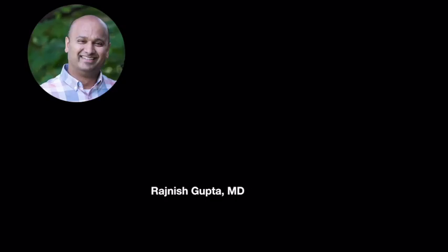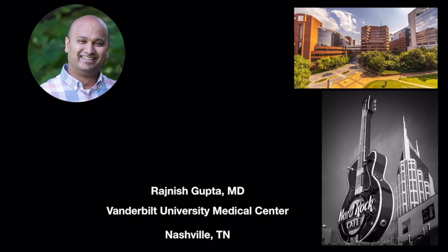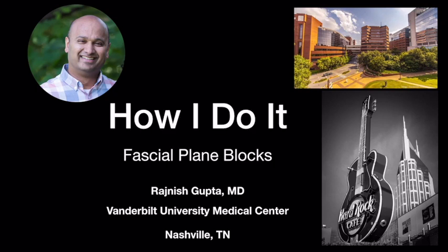This is Raj Gupta. I'm talking to you from Vanderbilt University Medical Center in Nashville, Tennessee, and this is my short video on how I do some fascial plane blocks.